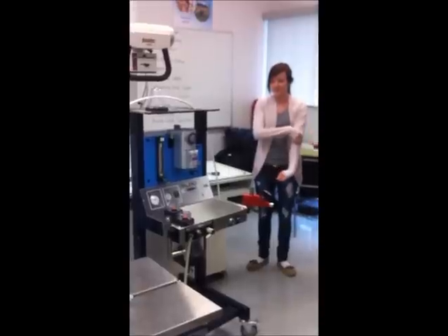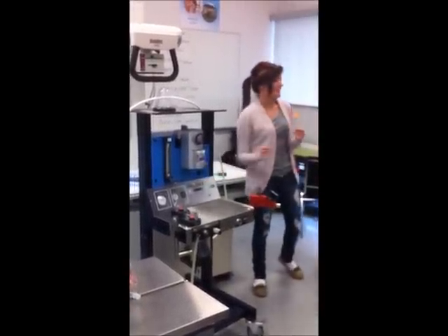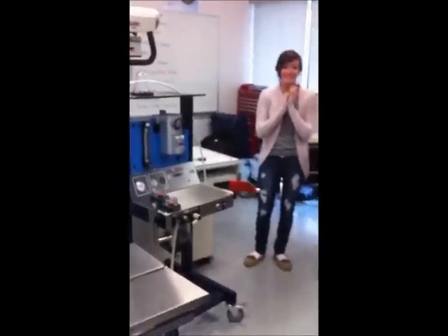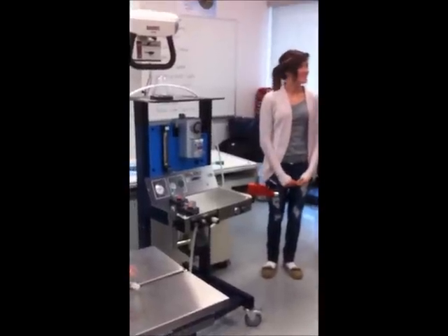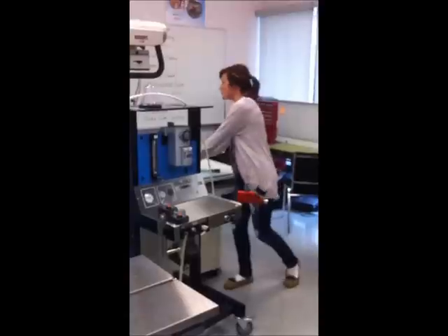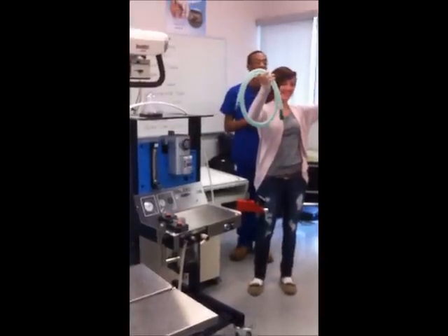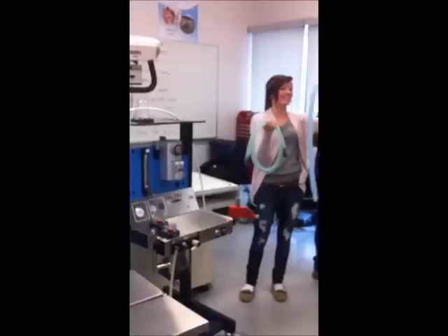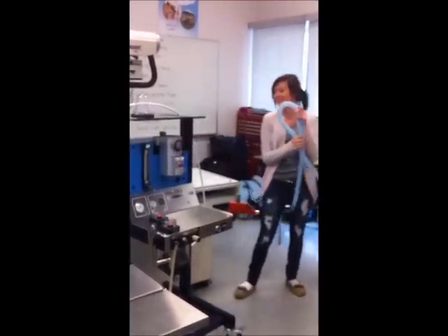Okay, so first off, he's 10 kilograms. Which system would you use? Keep in mind, you're on camera. Rebreathing system. Yes, you will be using that one. Guys, you are helping her. Now, go for it. Do you know what the oxygen goes in? So, what tube should we use? The big one. Why? Bigger dog, bigger animal, yep.